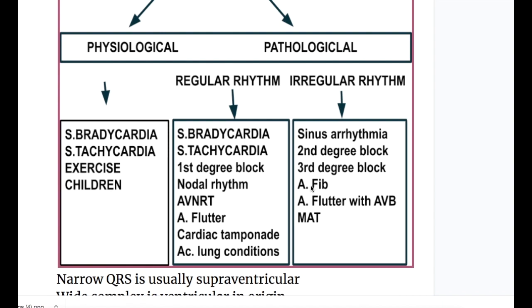We will discuss wide QRS separately. Other causes of regular rhythm narrow QRS are nodal or junctional rhythm, atrioventricular nodal reentrant tachycardia (AVNRT), cardiac tamponade, and acute lung conditions. Now let's discuss the physiological causes of narrow QRS.